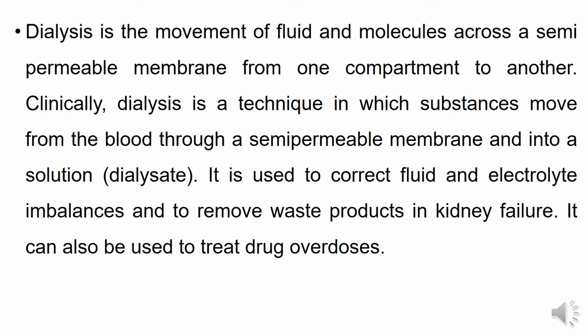Dialysis is the movement of fluid and molecules across a semi-permeable membrane from one compartment to another. Clinically, dialysis is a technique in which substances move from the blood through a semi-permeable membrane and into a solution. It is used to correct fluid and electrolyte imbalances, and also to remove waste products.